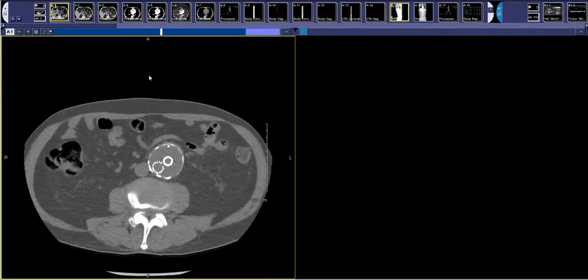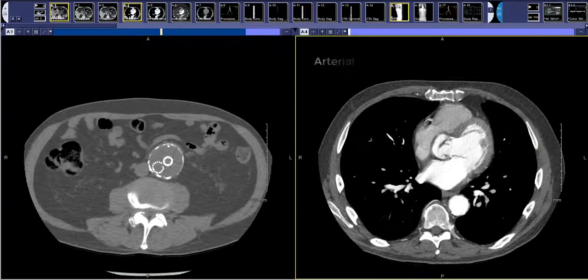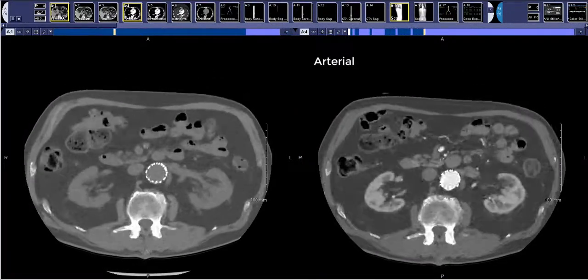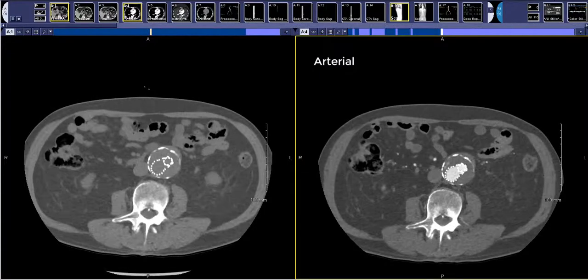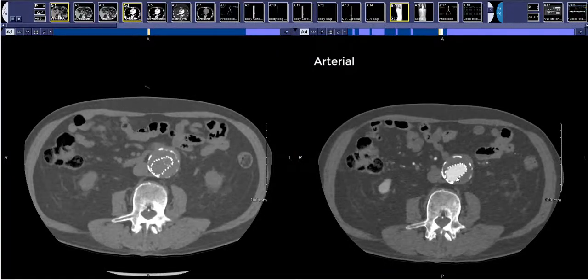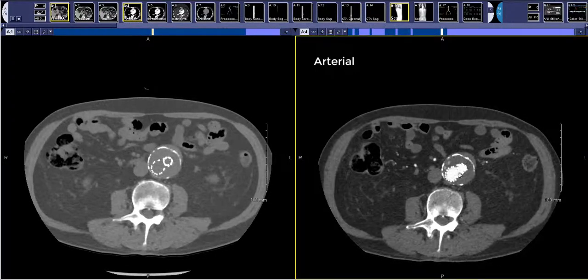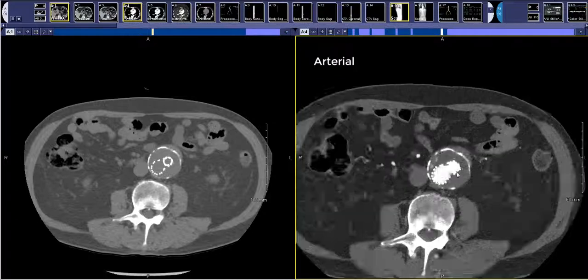The next sequence obtained is an arterial phase study. That's important to look through because it gives you an idea of where contrast is going. The purpose of an endograft is to cause all the blood to go through the endograft outside of the aneurysm sac and allow the aneurysm sac to be depressurized. You can see here that there is unfortunately a blush of high attenuation contrast within the excluded part of the aneurysm.